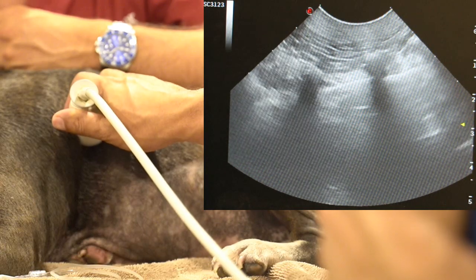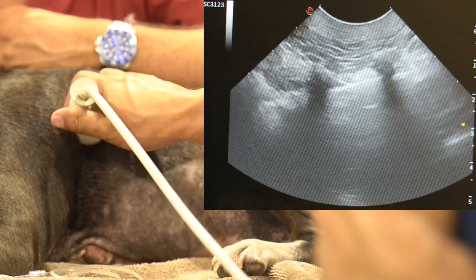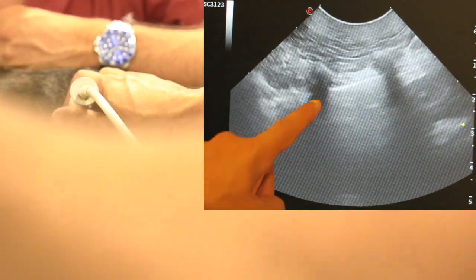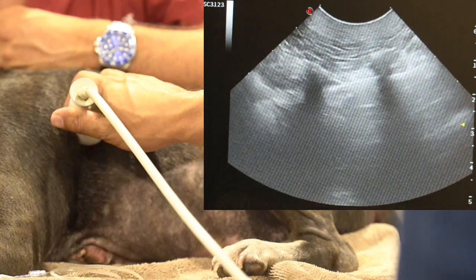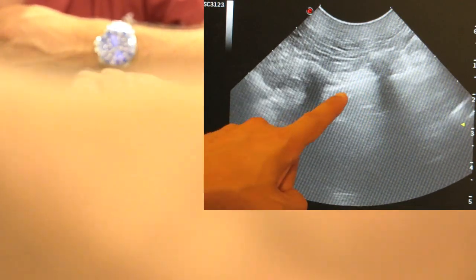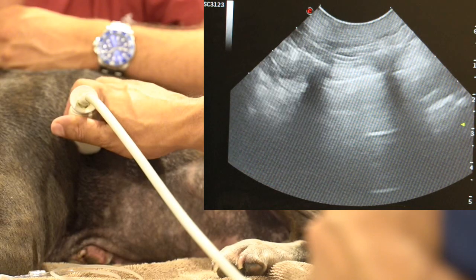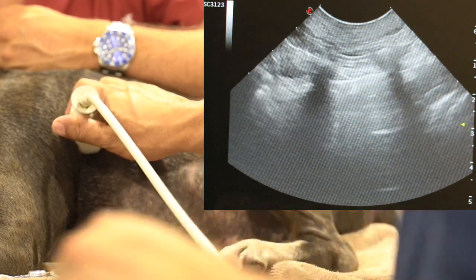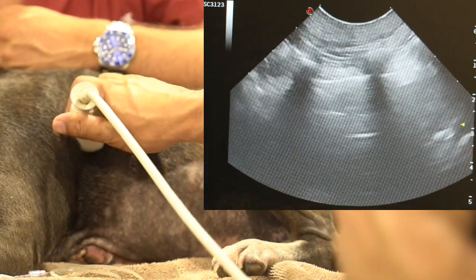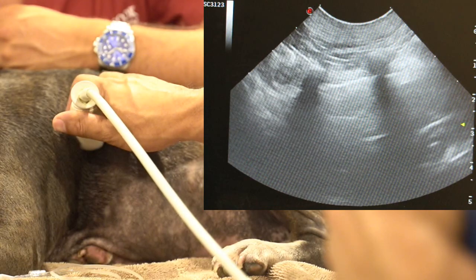So that's dry lung. We know it's not a pneumothorax because we have lung adhered to the chest wall — we have glide sign — and we have A lines. So the dorsal corner fields are dry.